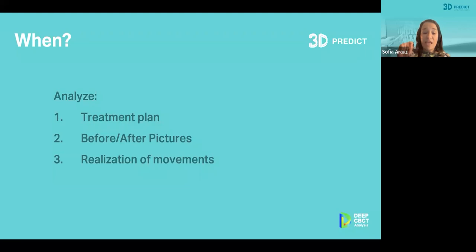But sometimes the aligner fits, but there's one tooth that is not tracking and you notice it right away. Let's say you did a lot of rotation on one canine, everything else seems to be tracking except that canine, which is kind of tracking, but is lagging a little and not matching perfectly with the treatment plan. Then you have the option of waiting until the end of the treatment plan to submit for a refinement. So there's a difference between the aligner not fitting at all versus one tooth not tracking, in which case you have the option of waiting till the end of the treatment.